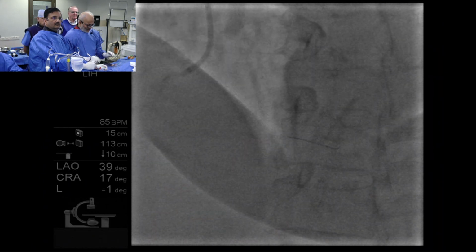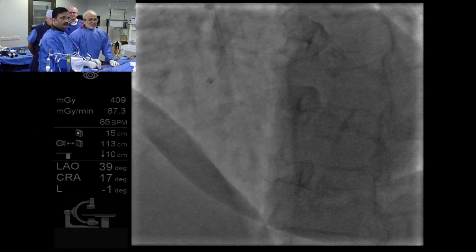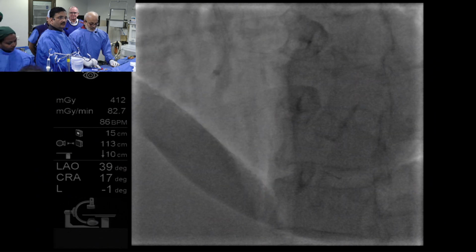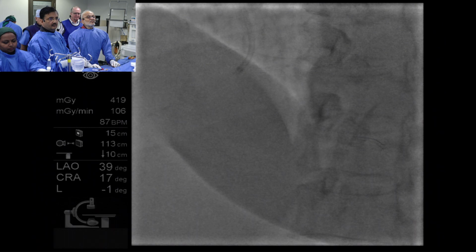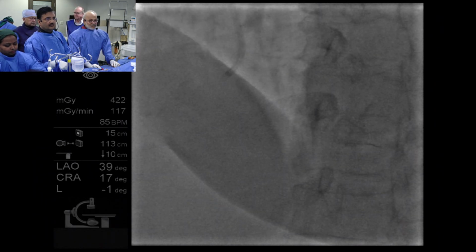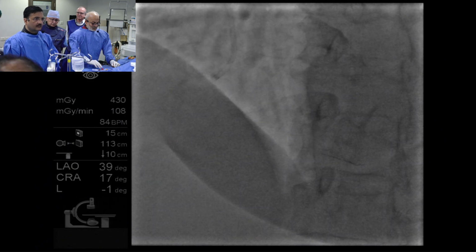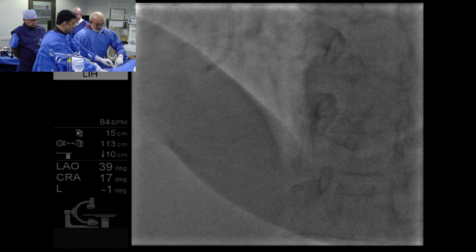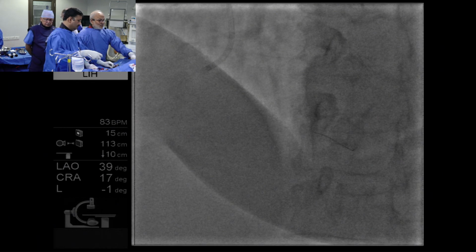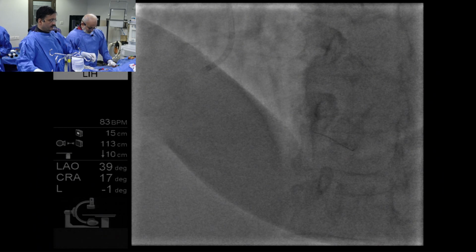Just a small comment about using adrenaline. In case you are not ready with the pacemaker and aminophylline might take time, there is a method of giving adrenaline. You just take the adrenaline and remove everything, then again flush it with saline, and whatever small amount remains can be injected intracoronary and will have instant effect. Instead of giving IV adrenaline or intracoronary adrenaline without dilution, this type of adrenaline works immediately.